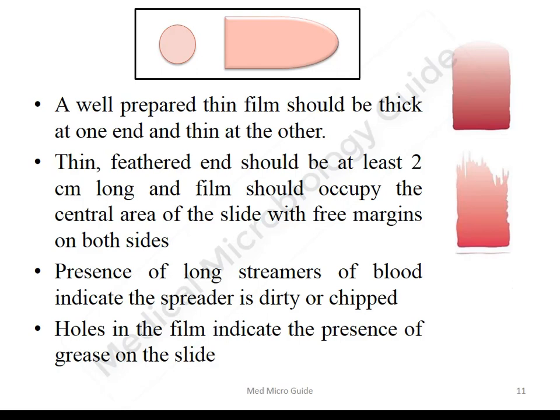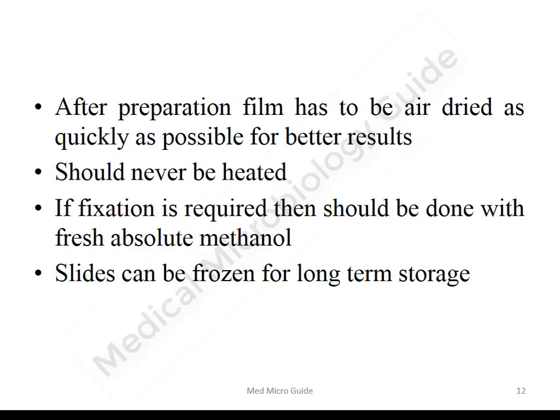If you see long streamers of blood, that indicates the spreader slide was either dirty or chipped. If you see holes in the film, it indicates the slide was not clean — there was grease on the slide. After preparation of the thin film, it must be air dried as quickly as possible. It should never be heated, and if fixation is required, it should be done with fresh absolute methanol. If you want to store the slides for a longer period, the slide should be frozen.